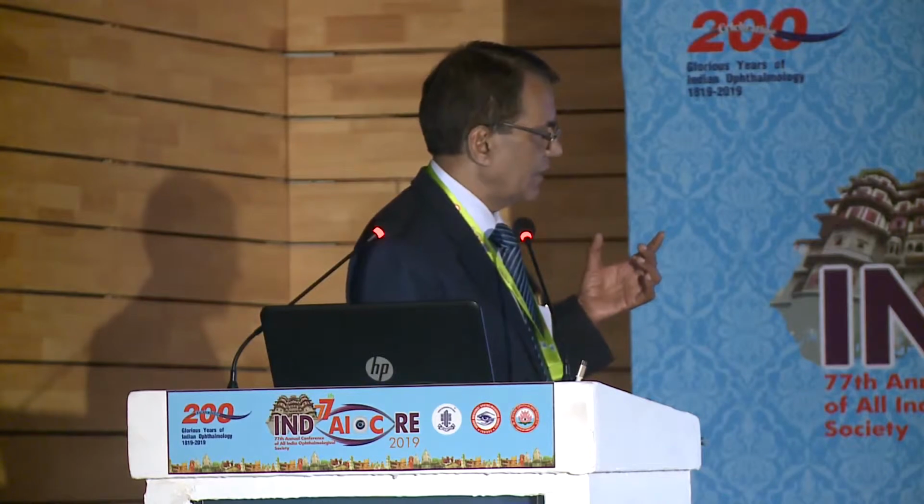Now, this is the RNFL curve which is given, the RNFL thickness curve, this one. And this one is the quadrant-wise measurement of the retinal nerve fiber layer thickness. So basically concentrate not on this, concentrate more on this clock hour wise, because that gives you a very localized location, especially in the upper and the lower, mainly upper temporal, lower temporal, that is more important for glaucoma. So whether it's a red color or yellow or green, those things you have to see. Also, this is just the abnormality you will see. Whether it is glaucoma or not, you have to correlate clinically. You have to take the patient in entirety.